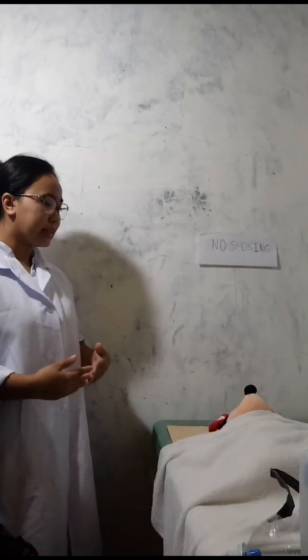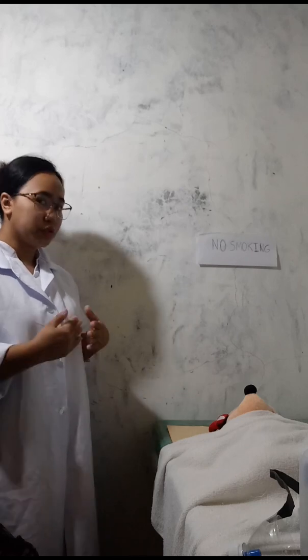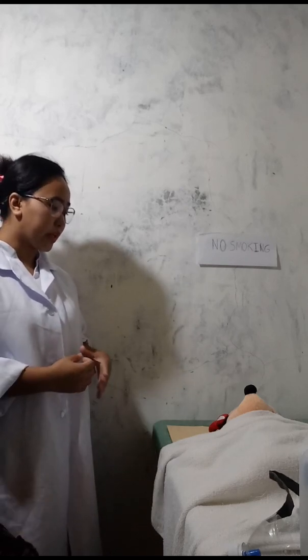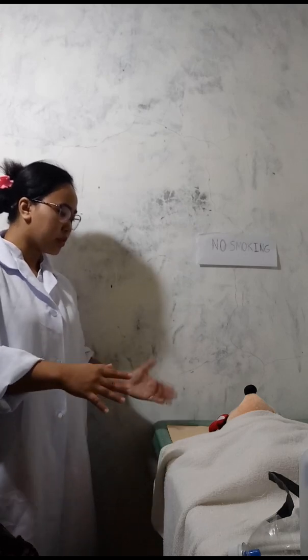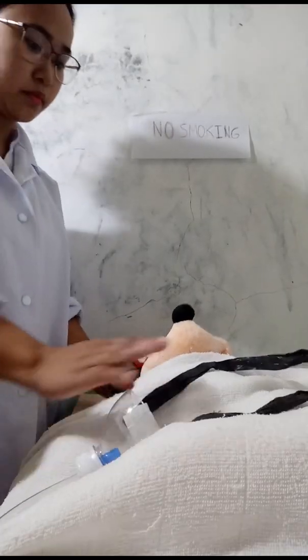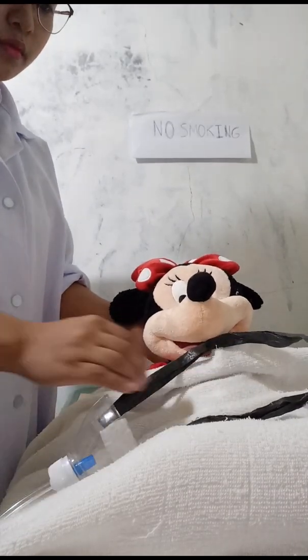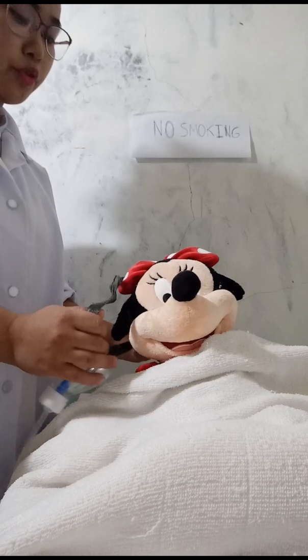Ma'am, my name is Cez Reyes from NUST, and for today po, I will be your student nurse. Bibigyan ko lang po kayo ng oxygen ngayon as ordered by your doctor po. Saglit na itaas po yung ulo nyo. Okay lang po ba? Okay po. Ma'am, pikit po yung mata.